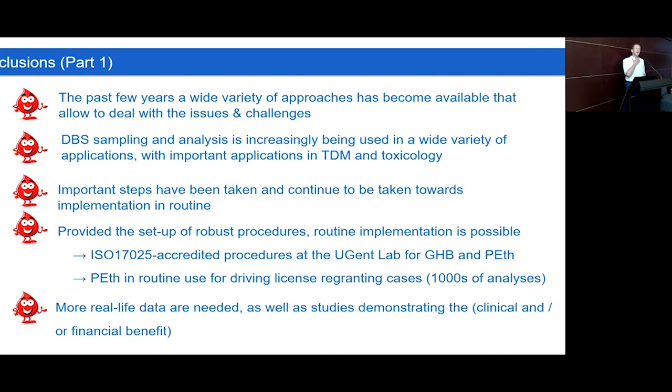We do need more real-life data, as well as studies demonstrating the clinical and or financial benefits. With that, I mean, if you have better patient follow-up, and I refer to the variation in concentrations that we saw, for instance, with this tyrosine kinase inhibitor, this may be relevant. Just avoiding one or even a few hospitalizations can be really beneficial, certainly in the context of work that's being performed here. If you work on antibiotics and you would have home sampling, just avoiding some hospitalizations can already be quite cost beneficial from a society perspective, because one hospitalization costs an immense amount of money, whereas this monitoring can be done relatively cheaply.